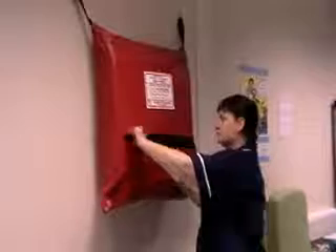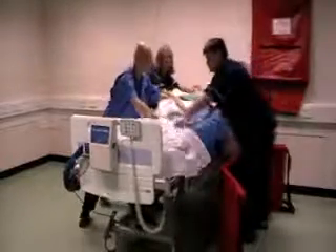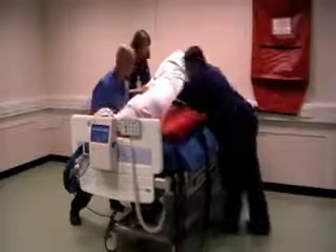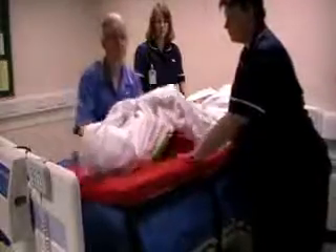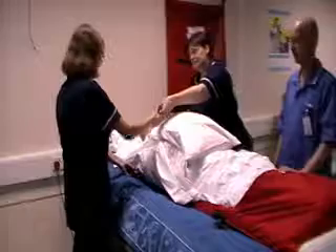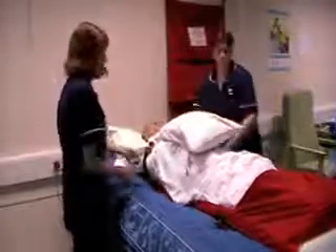Go to the nearest ski pad. Pull the lower flap enabling the ski pad to drop down. There is no need to unhook the bag. Wrap the patient in a sheet and then roll the patient onto their side. Place the ski pad along the side of the patient and then roll the patient back onto the ski pad. Two or three people may be required to slide the ski pad under the patient and then adjust. Lift the legs from under the knees and slide the patient's feet into the ski pad pocket. Place a pillow onto the patient's chest. Fasten the straps across the patient's legs and chest, pulling tight to secure the patient.